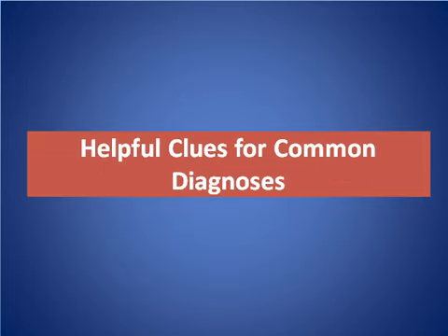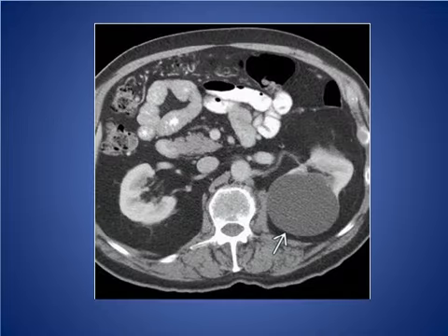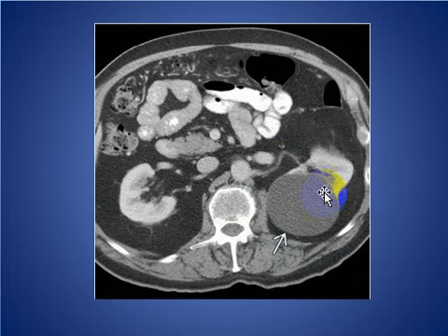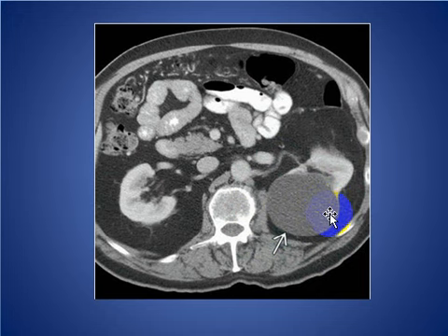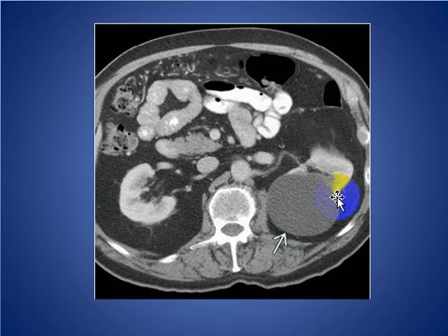The clue for common differential diagnosis: renal cysts are by far the most common retroperitoneal cystic mass lesion, seen in more than 50% of all adults. Here we see an axial contrast-enhanced CT scan with a cyst in the left kidney — non-enhancing, water density, non-mural — well-marginated, with the claw sign indicating the cyst is renal in origin.